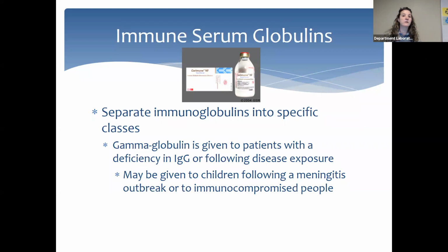Would you do an antibody screening before giving that? Yep, so you're going to pick this up in your antibody screen. All of your cells are going to be positive. You're going to do a panel. All of your cells are going to be positive. Your DAT could be positive. I meant for the patient that's given this intravenously.